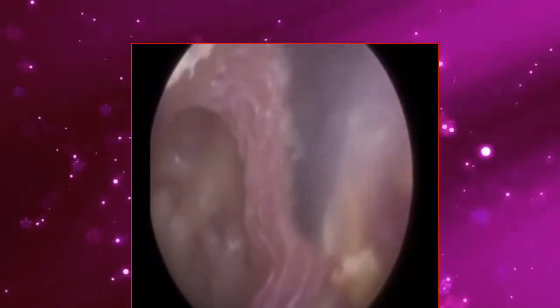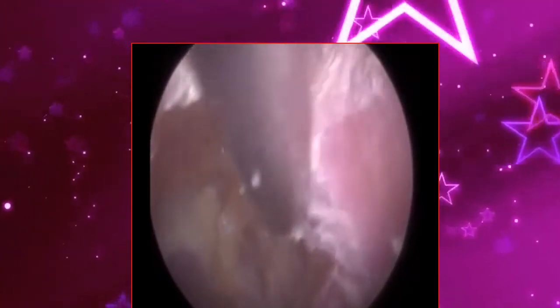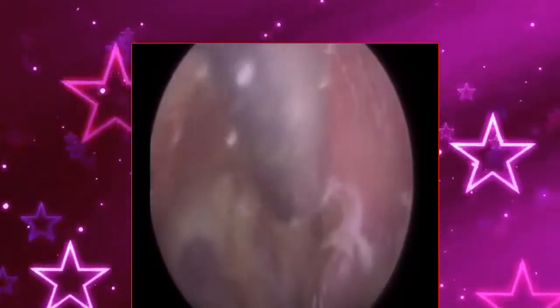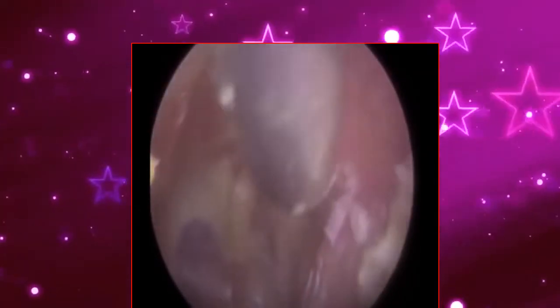It's quite interesting to see all the structure of the eardrum, and also the middle ear ossicles. So there's three ossicles. The ossicles are the middle ear bones. They're the smallest bones in the body. The more widespread known as the hammer, anvil and stirrup. Medically, the hammer bone is called the malleus, the anvil is called the incus, and the stirrup is called the stapes bone. And those bones, they vibrate in response to sound hitting the eardrum.